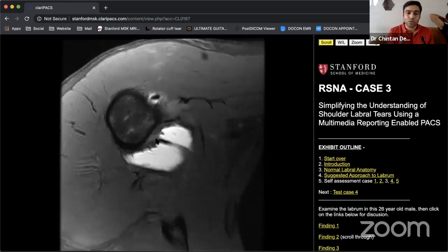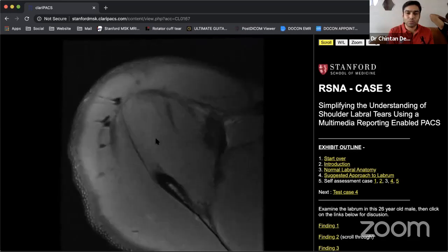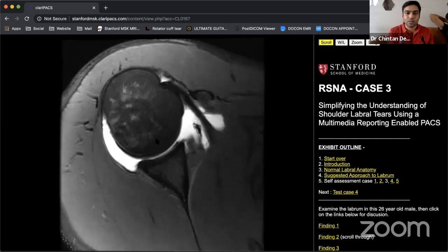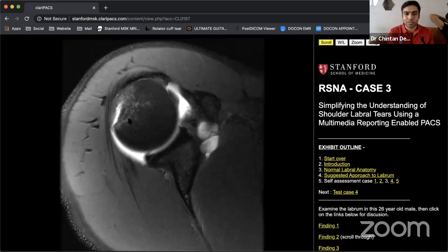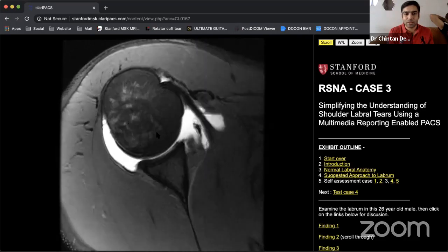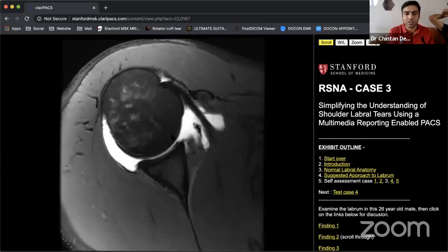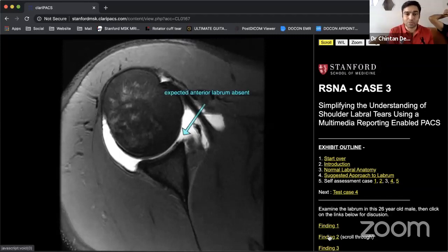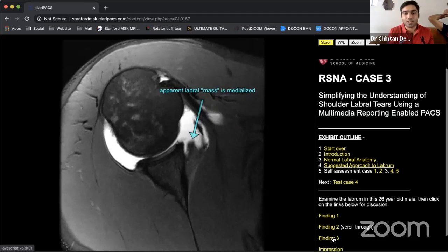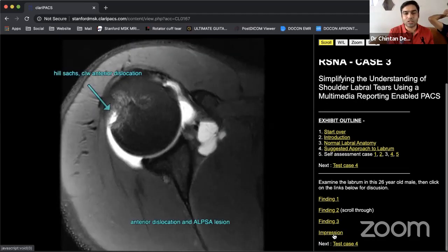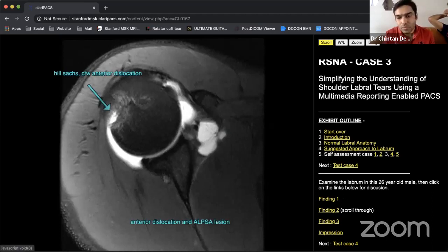The next case shows a lot of joint edema. The Hill-Sachs defect is quite deep. Going down, there is no labrum attachment at all — the entire mass has medialized. There is a large Hill-Sachs lesion. With this degree of displacement and medialization, you can call this an ALPSA lesion.